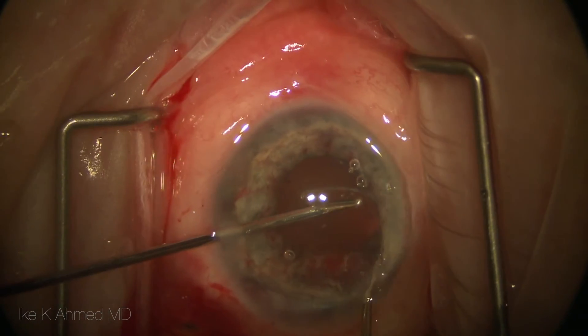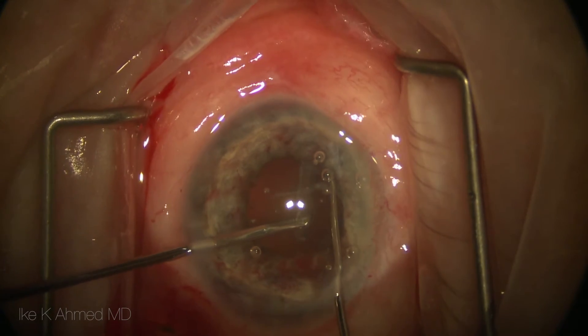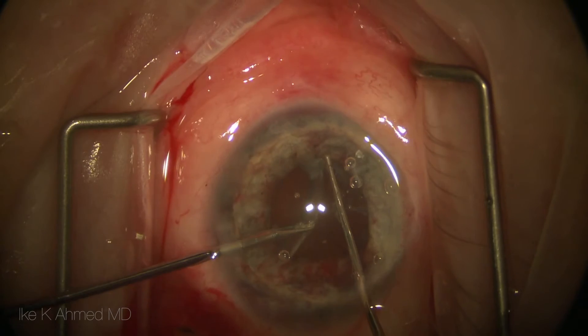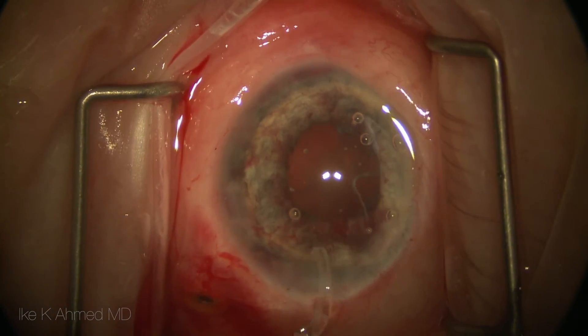There is a fair amount of fibrosis present and sheets of fibrotic tissue around this haptic. The haptic is grasped with a micrograsper and the sleeve of fibrotic tissue is pushed off of the haptic using a Kuglen hook.